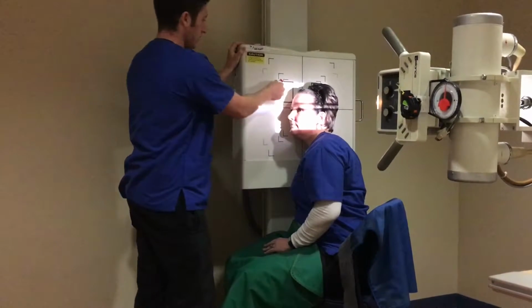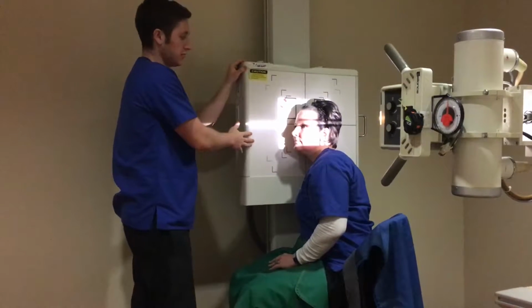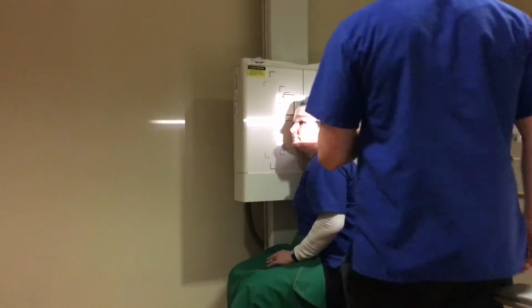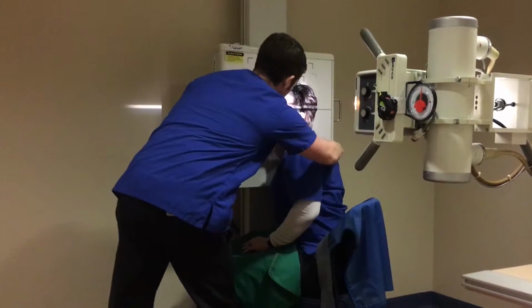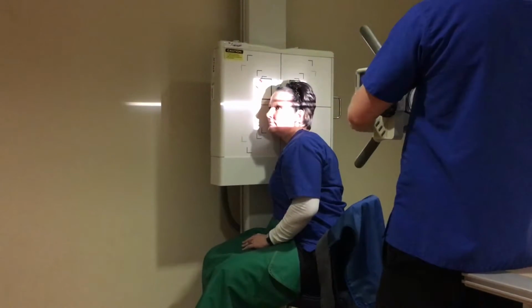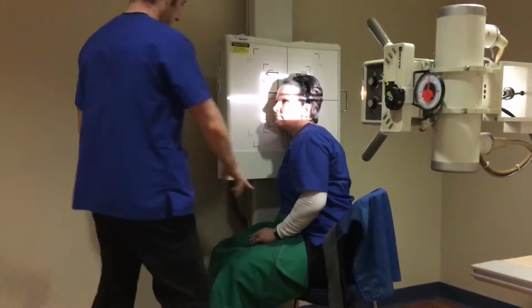I have a right marker on here because I'm doing a right lateral. It's important to put the side of interest closest to the image receptor when doing a lateral skull projection. I want to make sure that I didn't clip any anatomy posteriorly or anteriorly. So I'm going to have her come forward a little bit more. I can collimate a little bit side to side and top to bottom. I've got her shielded front and back.